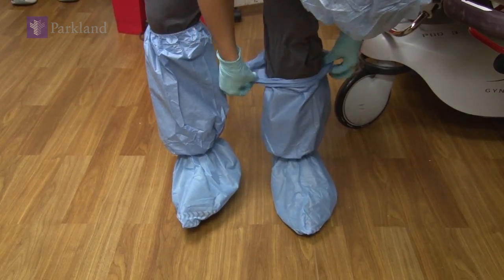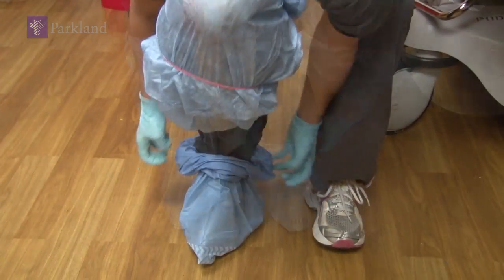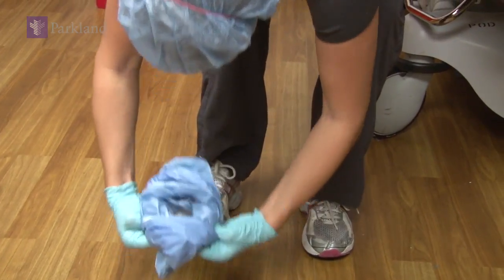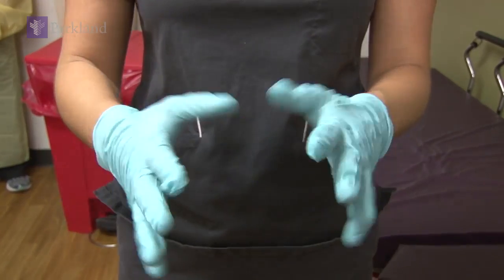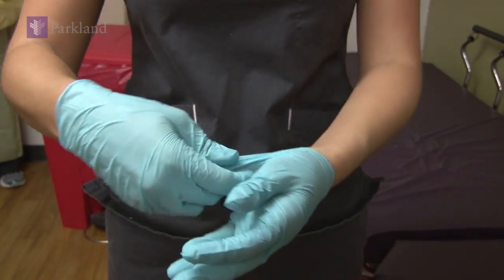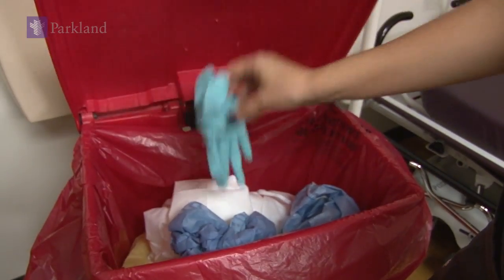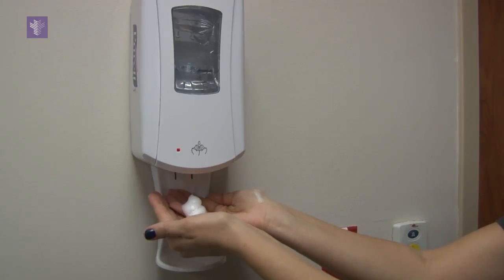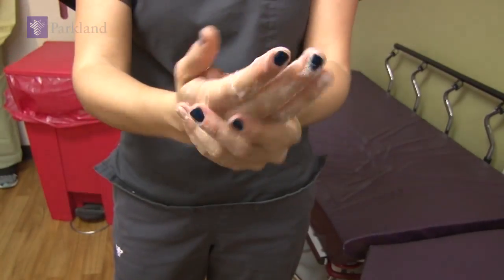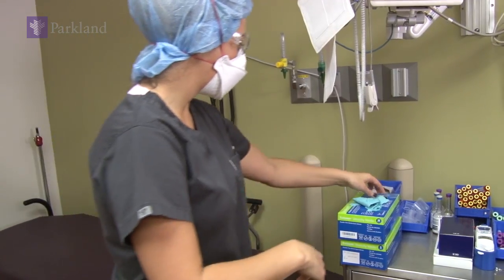Next, remove your boot covers one at a time, by rolling them down and outward, throwing each one away as you take it off. After your boot covers, remove your gloves with our standard procedure. Throw those away, perform hand hygiene, making certain that your hands are as dry as possible, and then put on a clean pair of gloves.